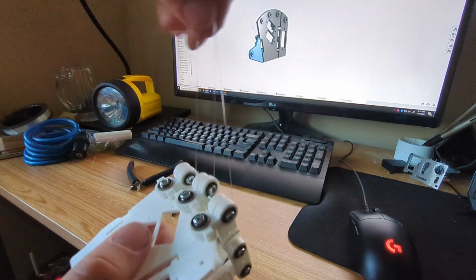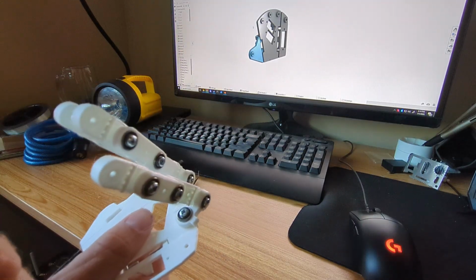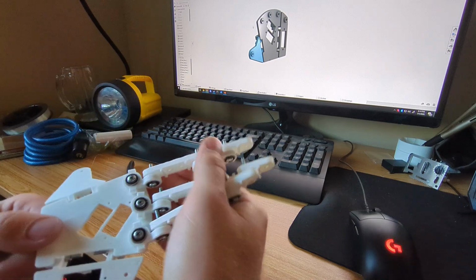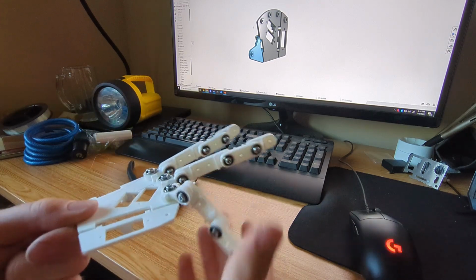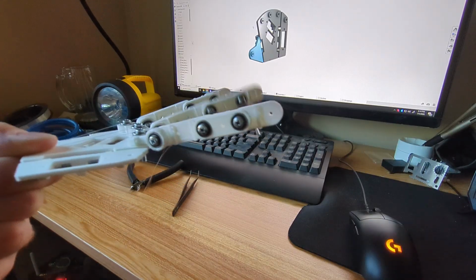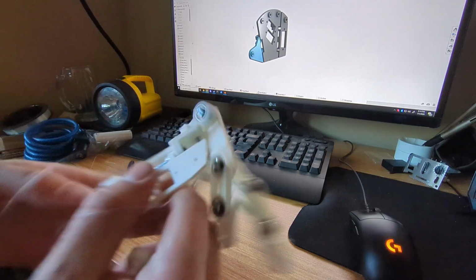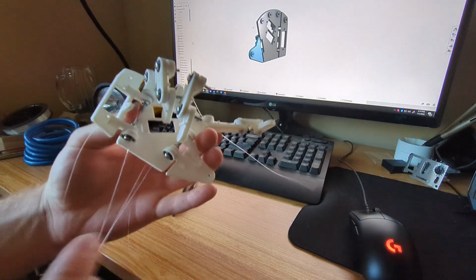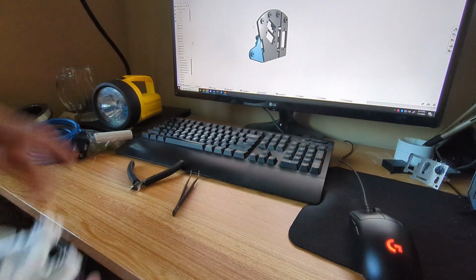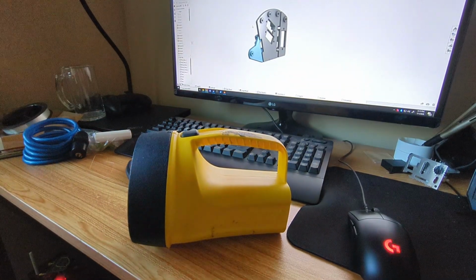I do have the other tendons, I think they show up here, wired for the opposite motion of the finger. So that'll let us keep them out, right? Until we pull to collapse them with the second one. I mentioned earlier, didn't print the pinky because the model was bugged out. But that will be coming.